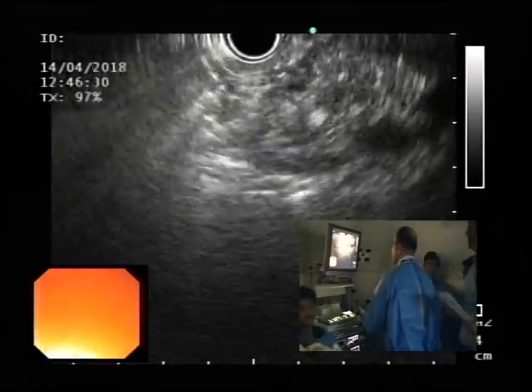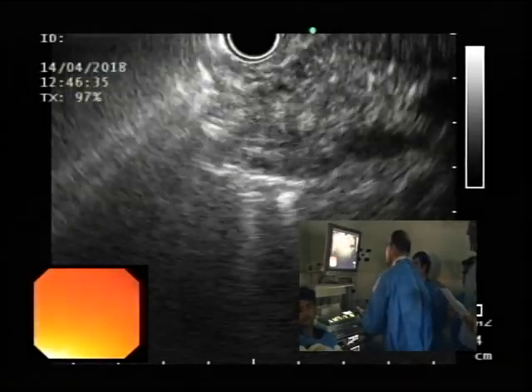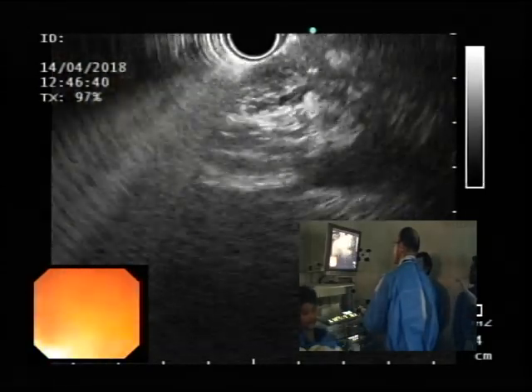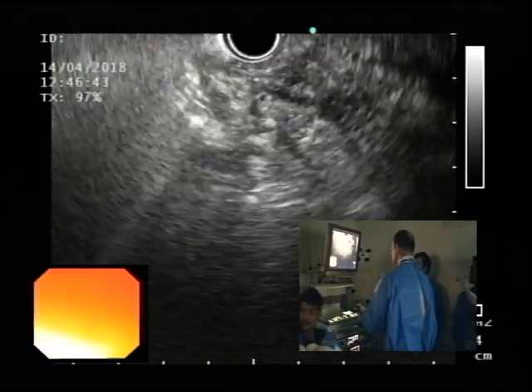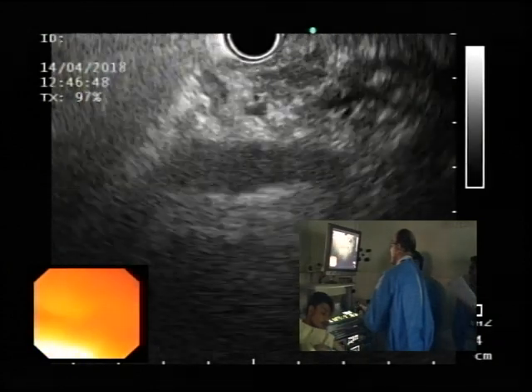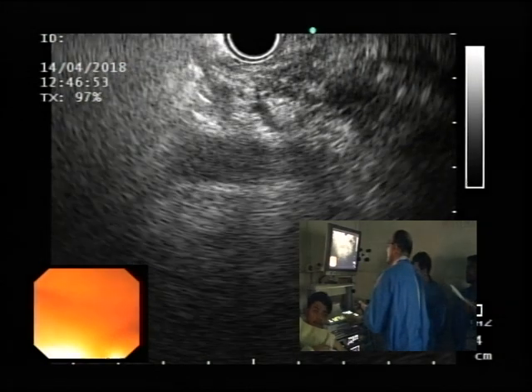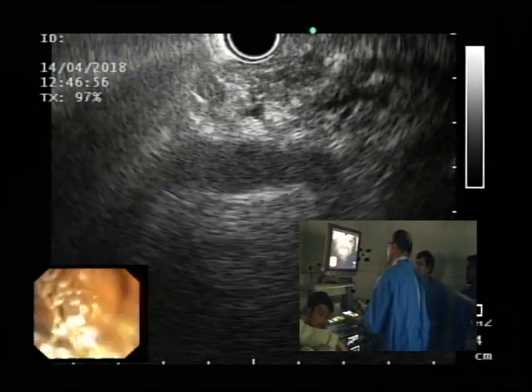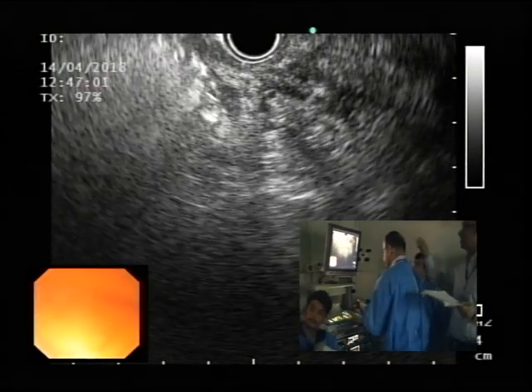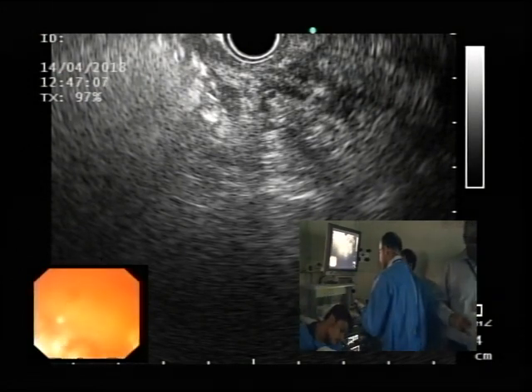We did the EUS on the 18th of February, almost 2 months ago. Finally, I think we have that major papilla view. I think there's a duct, and there's the bile duct above. Did you do a biliary? Yes, we saw the bile duct, that was normal. The pancreatic duct we could not; there was no dye going into the pancreatic duct from the major, so that's why we went into the minor. The minor did not show any dilatation. It was very similar to the view you've got of the pancreatic duct in the neck area, where it was really dilated?